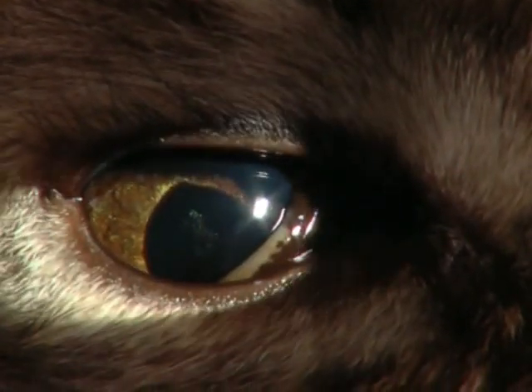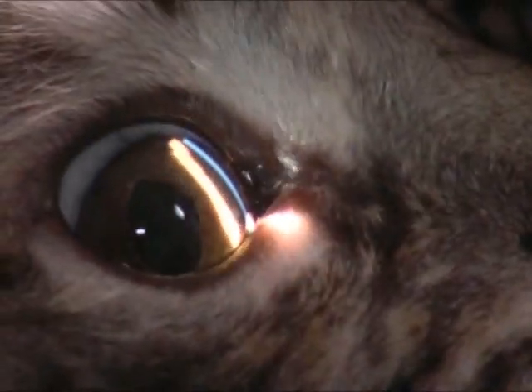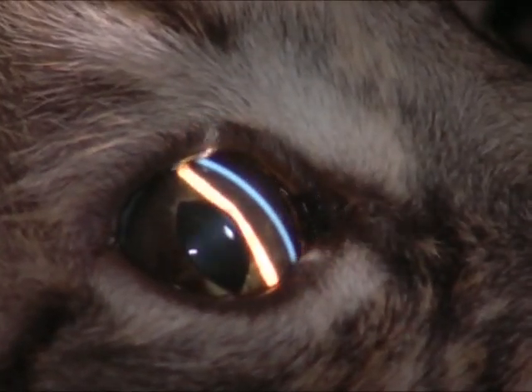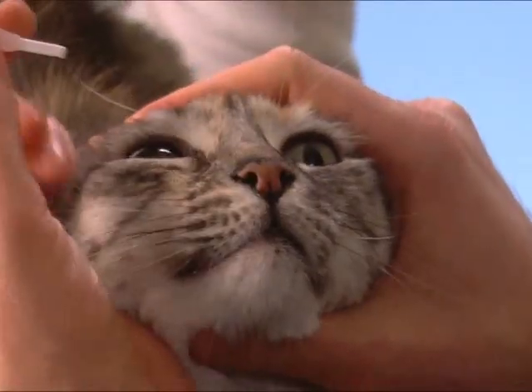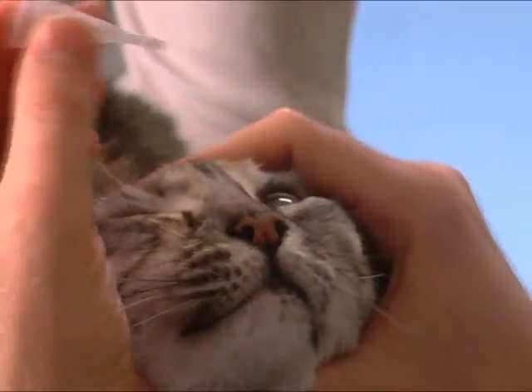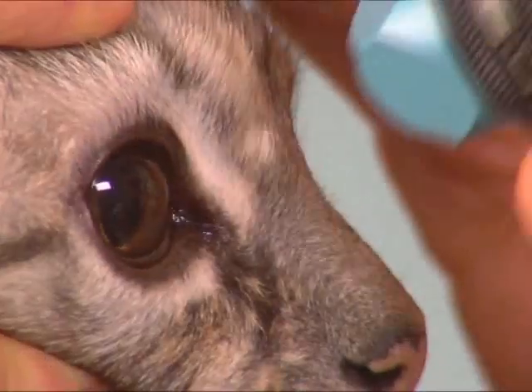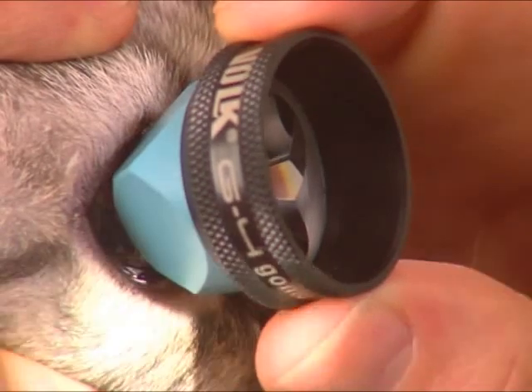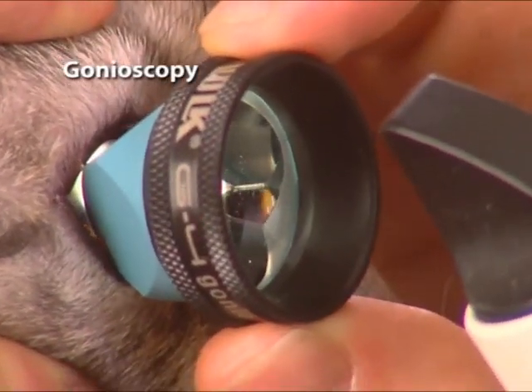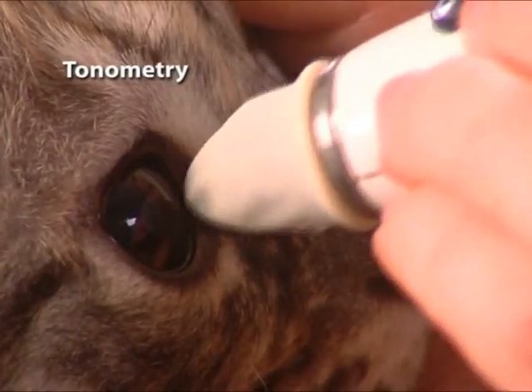If there is doubt as to the stage of disease, a slit beam is useful for more detailed examination of the iris and anterior chamber. Also, in both cats and dogs, iris melanoma can involve the iridocorneal angle, predisposing to glaucoma. Therefore, investigation of pigmented iris lesions ideally includes gonioscopy to visualize the drainage angle and tonometry to measure intraocular pressure.